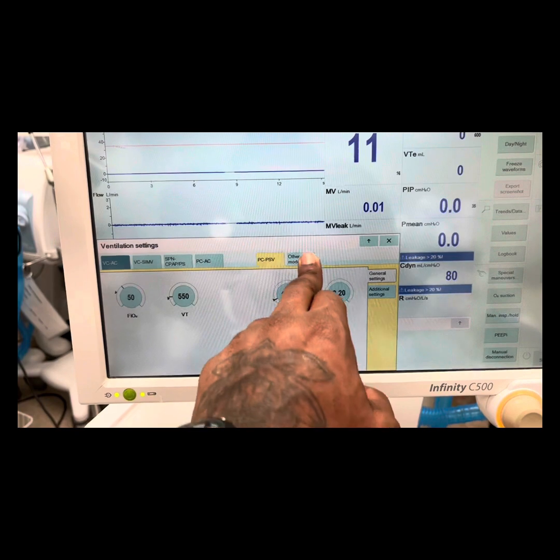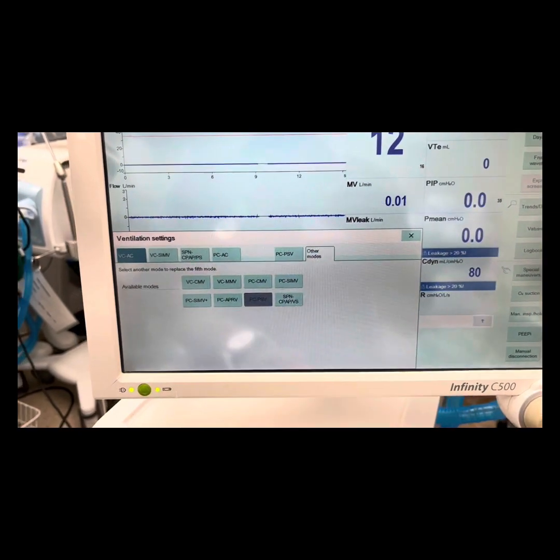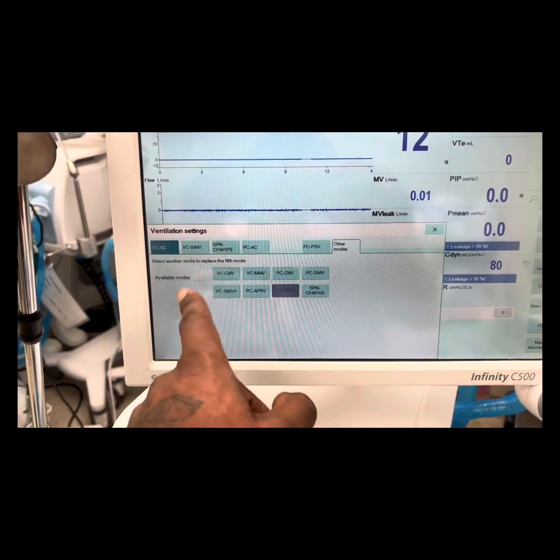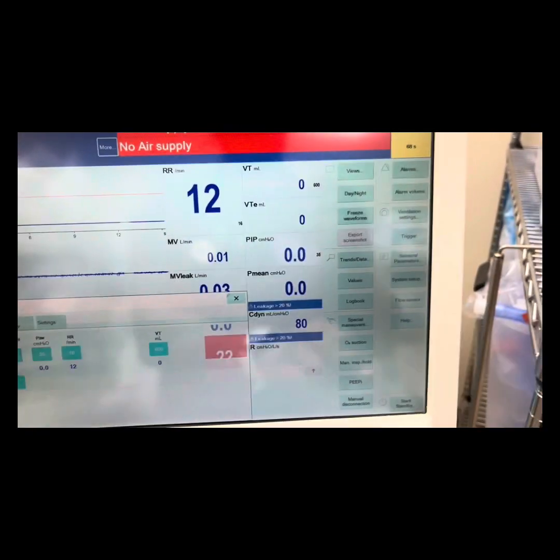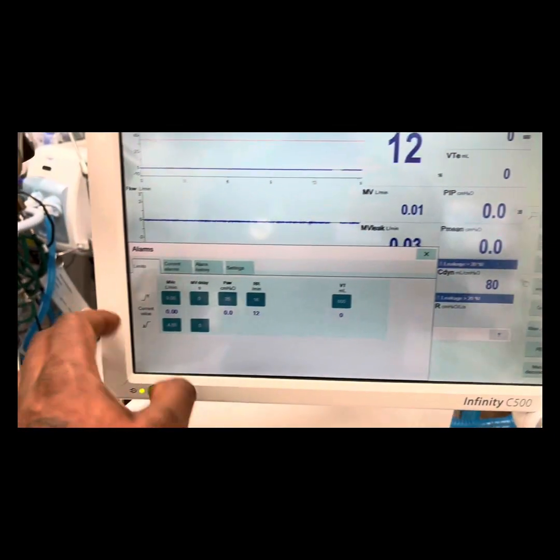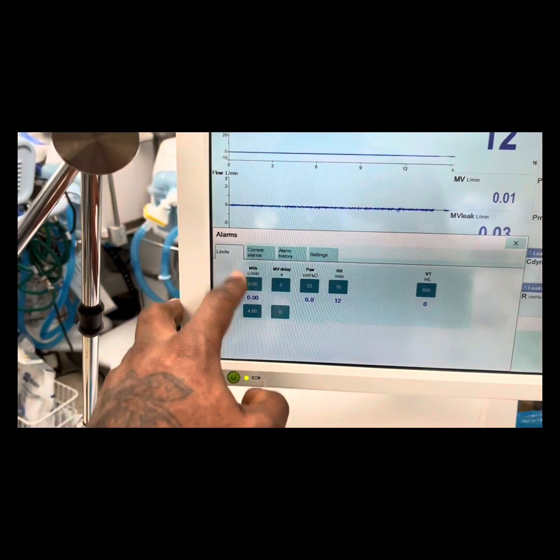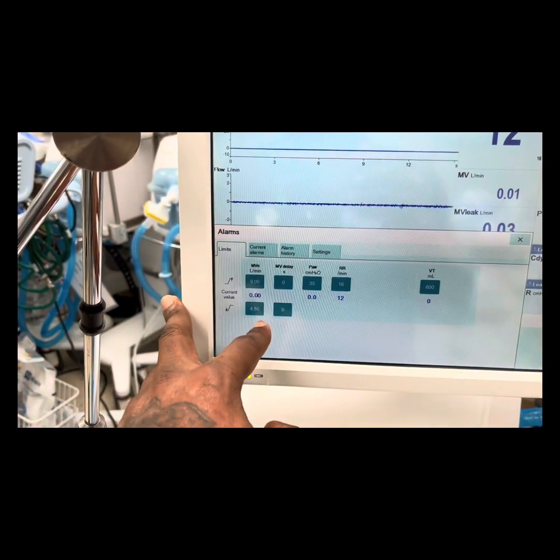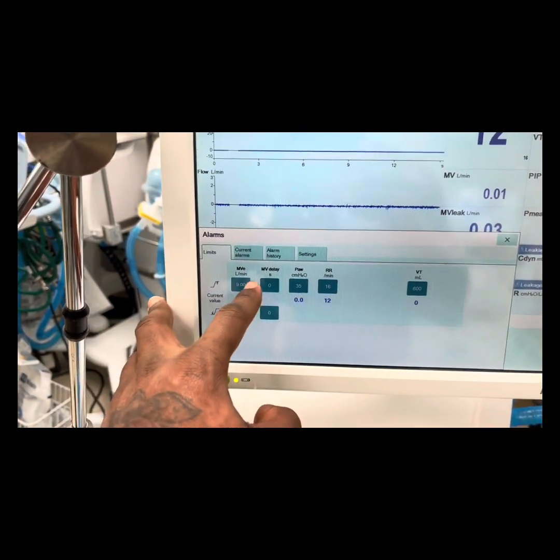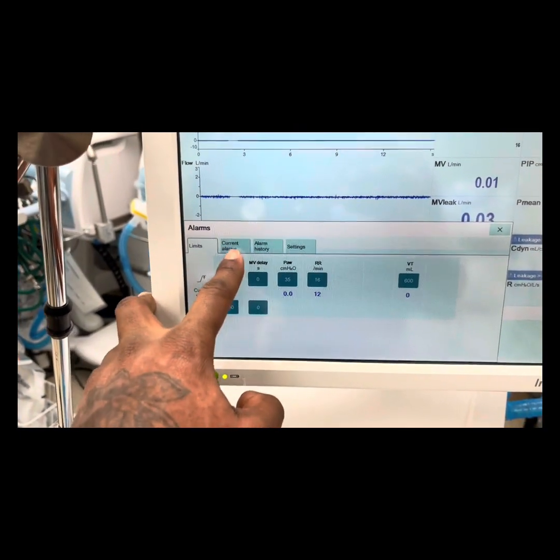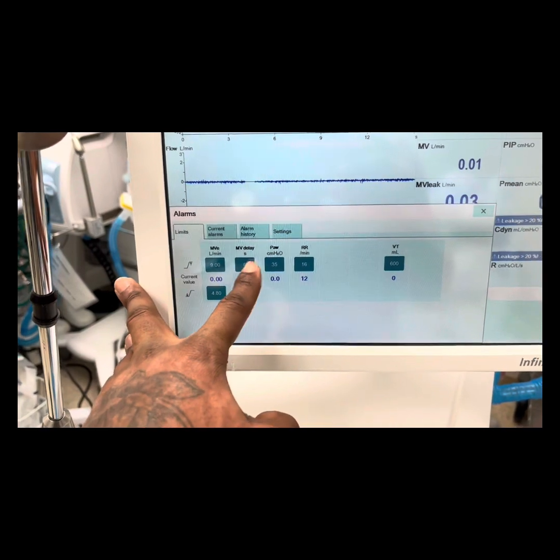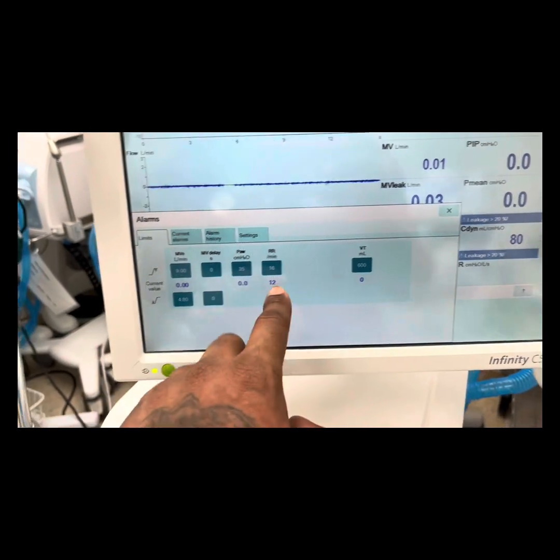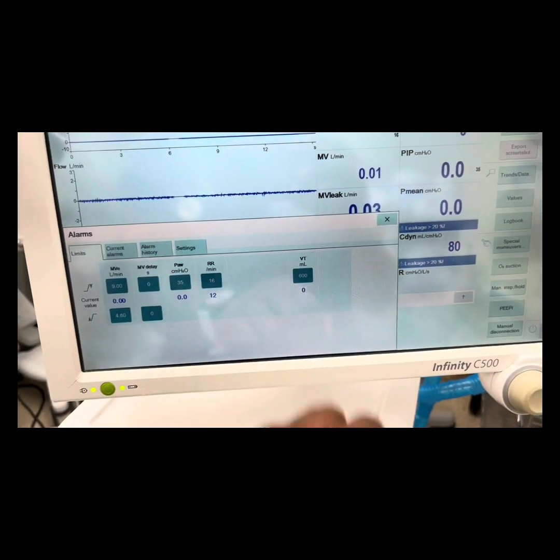Pressure support ventilation and other modes. Then alarms — alarm settings. High and low minute volume, pressure, respiratory rate, tidal volume.